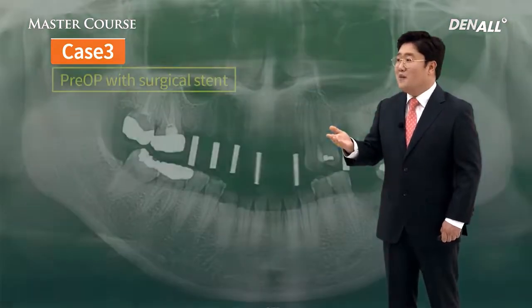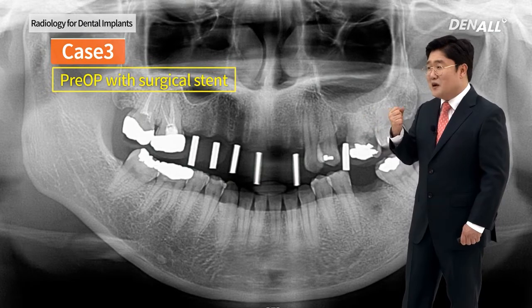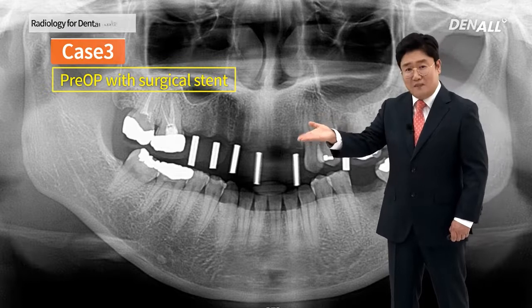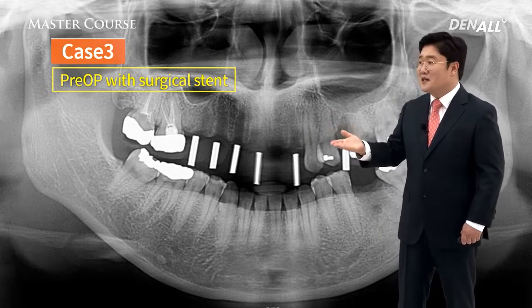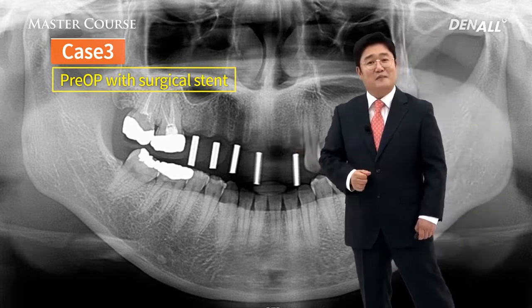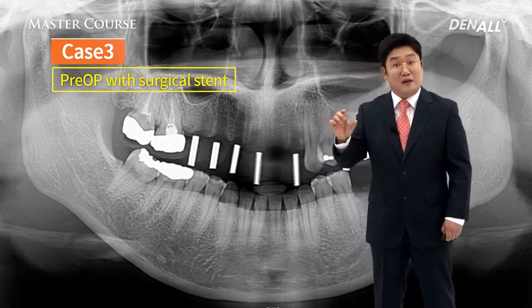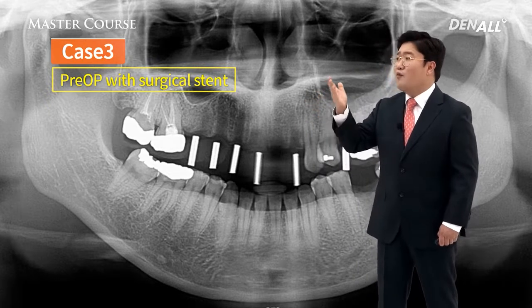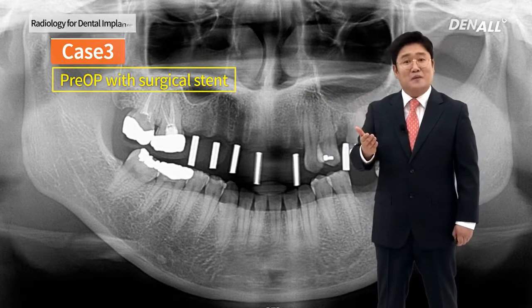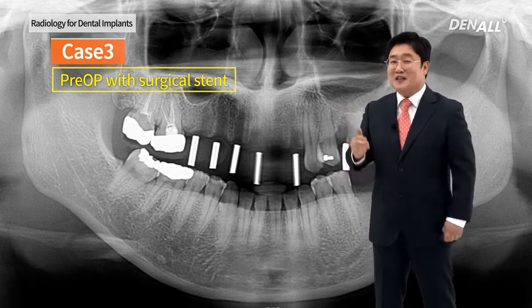After that, radiologic template or stent or guide is removed, and it is delivered to the patient mouth, and panorama is taken. You can see metal rods. Implants will be placed in those locations. The metal rods, we know the length accurately. Therefore, the degree of distortions, the vertical magnification, can be exactly identified. Therefore, implant diameter and length would be chosen.